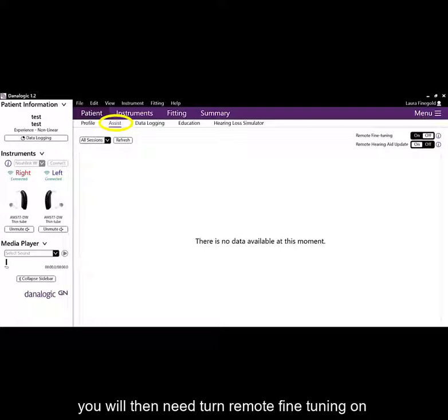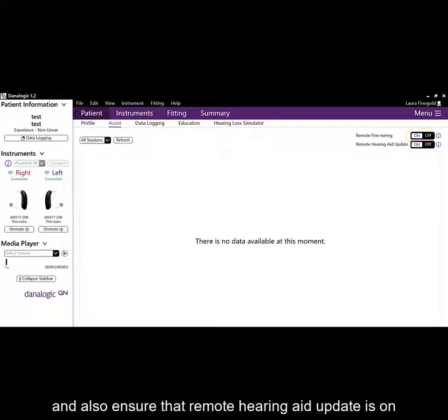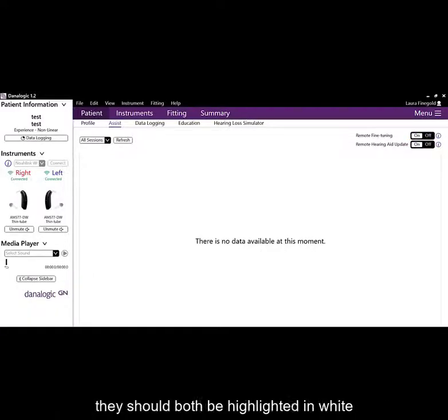You will then need to turn remote fine tuning on and also ensure that remote hearing aid update is on. They should both be highlighted in white.